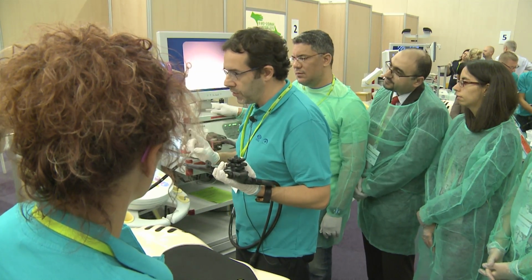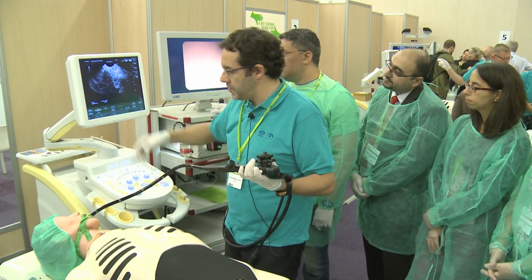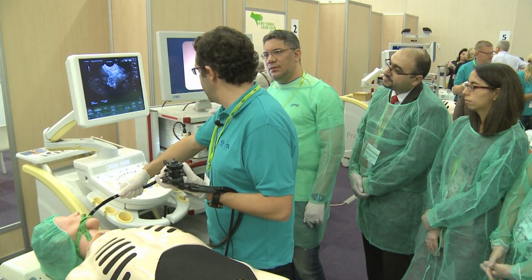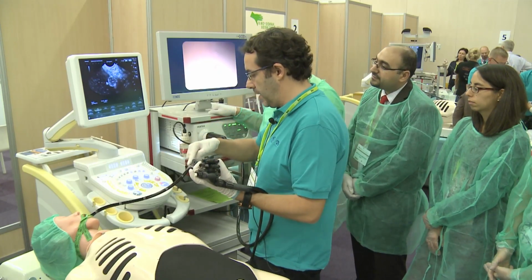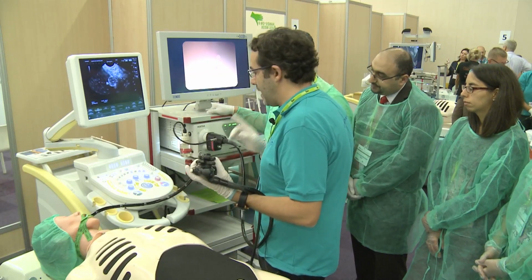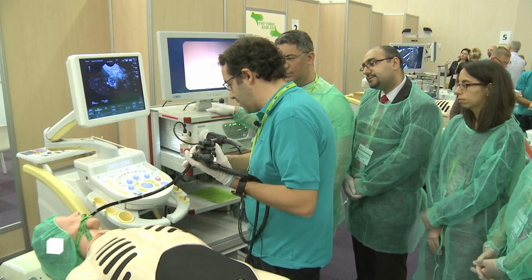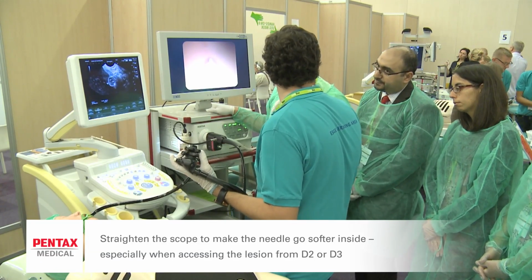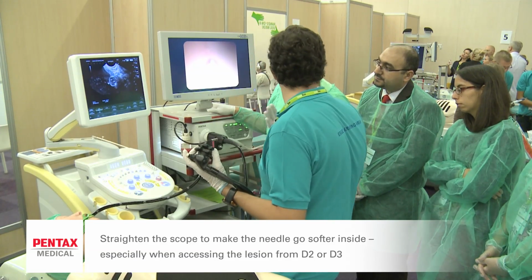It's very important for the needle to go out and be really stable. I can have this lesion in this position, but if I want to torque, I can also get it. But if I lift my right hand from the scope, I need it to be as fixed as possible so I can always reach the lesion. And the needle will go out of the scope more softly the straighter you have the scope. That is very important when you're trying to access a lesion from D2 or D3. You need to try to have the scope very straight to make the puncture easier.